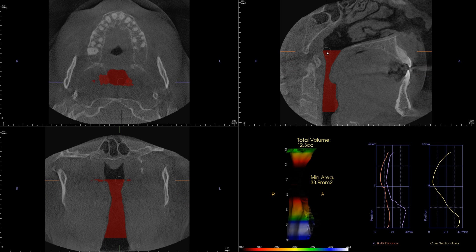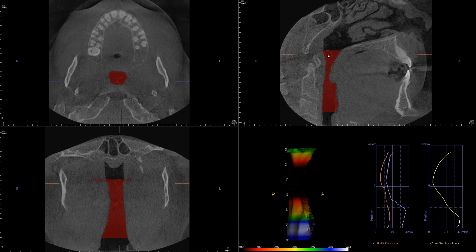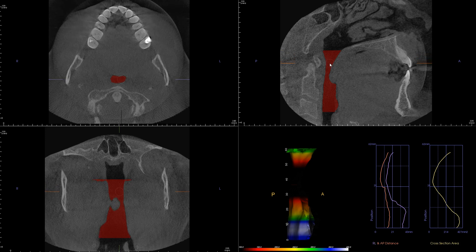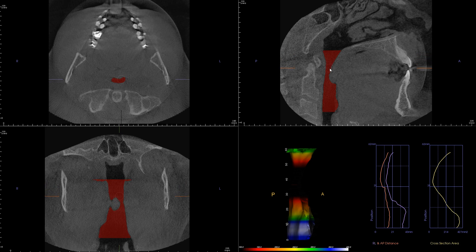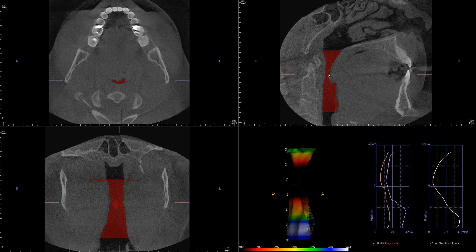Let's start at the level of the hard palate and I'm going to scroll the volume inferiorly — pay close attention to the overall shape of the airway. As I'm moving inferiorly, you can visualize that the airway is getting smaller both in the AP direction as well as in the transverse dimension. At about here it becomes the smallest portion.